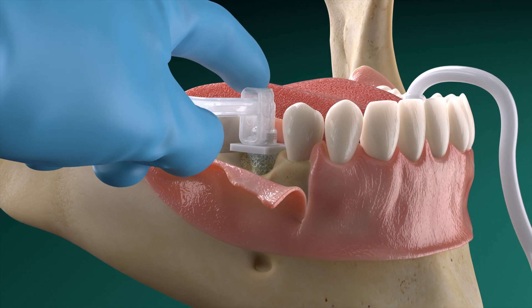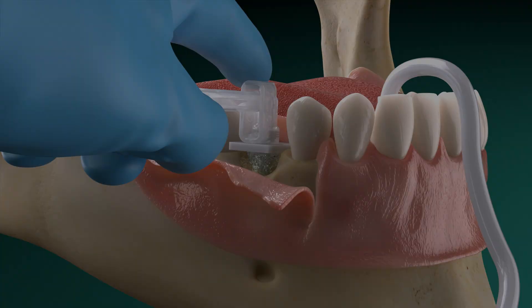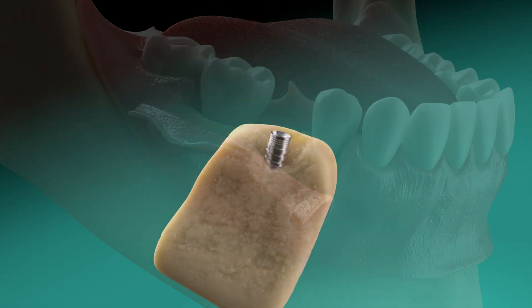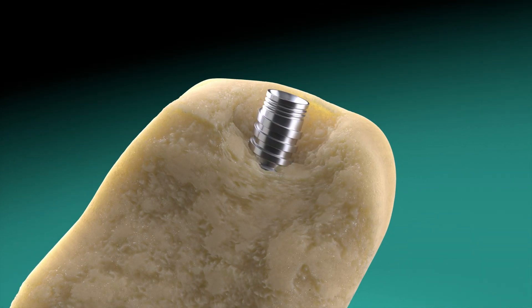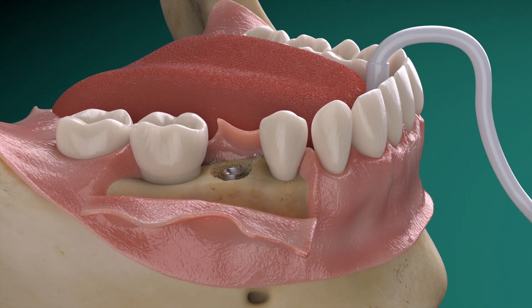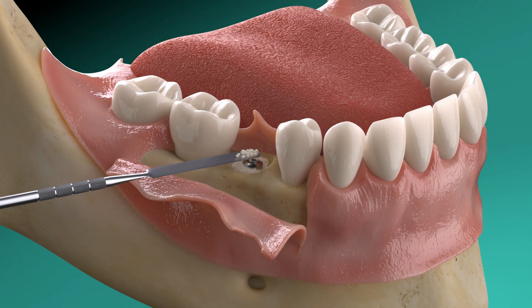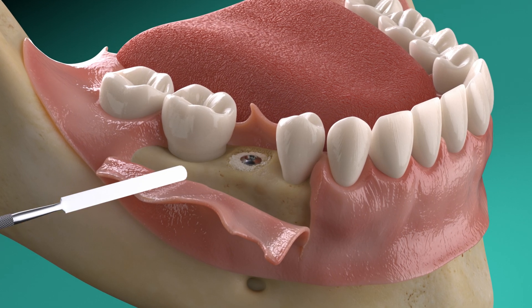Avoid placing the suction tip too close to the treated area. After just two minutes, the implant is completely clean. Remove any residual cleaning solution or coagulum, then insert a sterile cover screw or healing abutment. The site is now prepared for subsequent bone grafting.